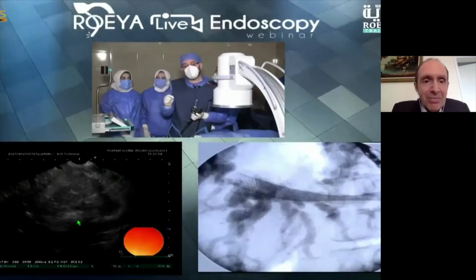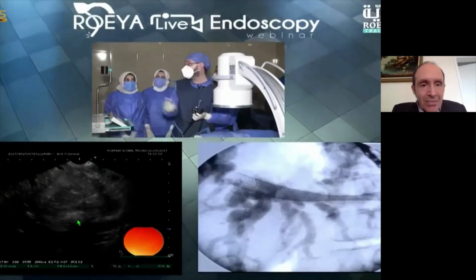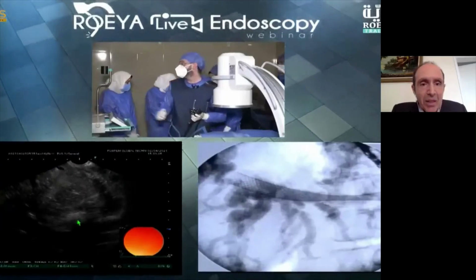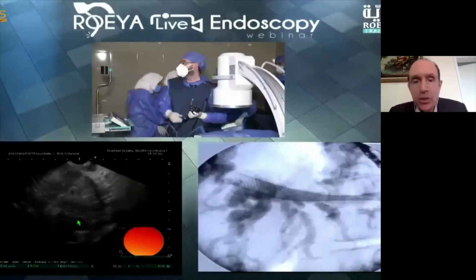If we still have enough time, I can show first the FNB technique and fanning technique. 22. Okay. Do we still have enough time? I've been told that we must end the session now.